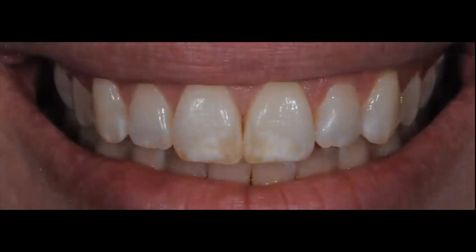You can see a side-by-side comparison of the preoperative and the postoperative smile. He was very, very happy with the outcome. And then we were able to match the shade, with no spots and the right value, when we were doing his mandibular incisors after implant therapy.